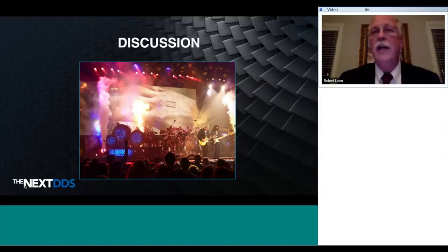You have ferrule. We haven't talked about ferrule. A 2 millimeter ferrule effect is required for retention. So if you don't have 2 millimeters of tooth structure above the finish line, you don't have ferrule effect, and that could adversely affect the retention and the ability of the crown not to just break off at some type of angle. So on a zirconia, all things being equal, I'm kind of splitting my differences now. I'm not doing a real heavy shoulder. I'm not doing a knife edge or a mini chamfer. I'm cutting those mostly at a millimeter. Rounded internal shoulder with a 90-degree butt joint at the end.